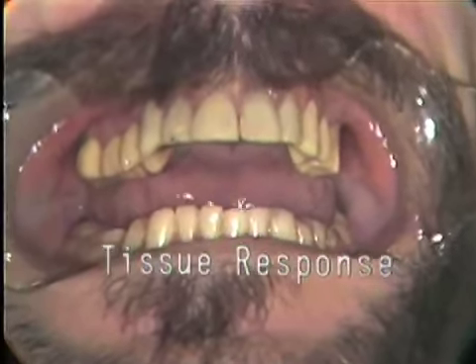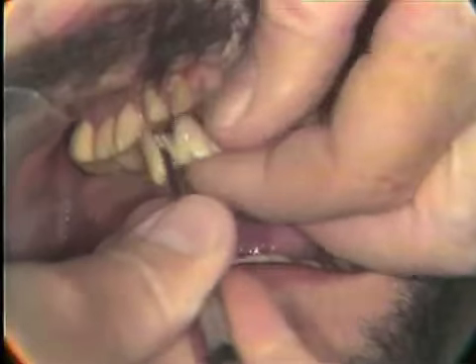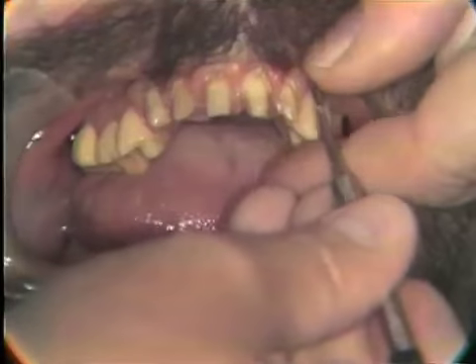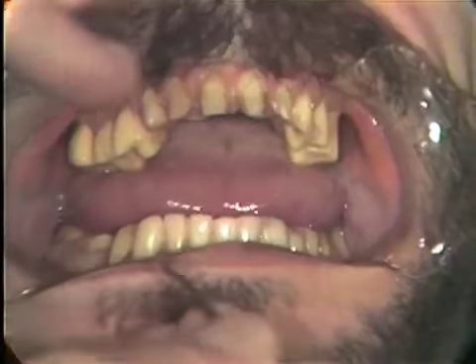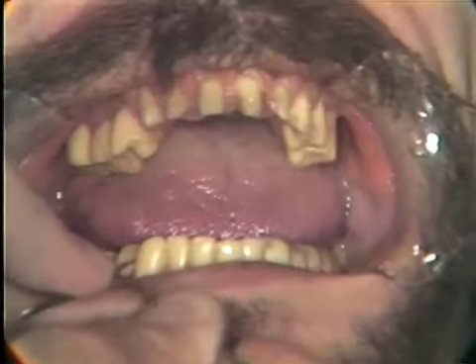You want to continually observe the tissue response to the temporary restorations. You will be removing the temporaries several times during the procedure, and you want to observe the reaction of the tissue to the temporaries. So every time you take the temporaries off, check each restoration and the tissue around the tooth. As you see here, these temporaries have been on for quite a while, and we've got pretty healthy tissue.